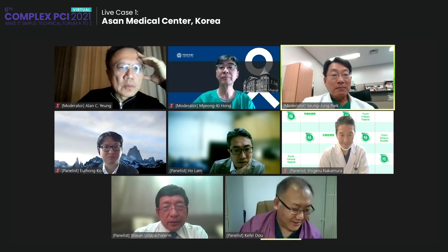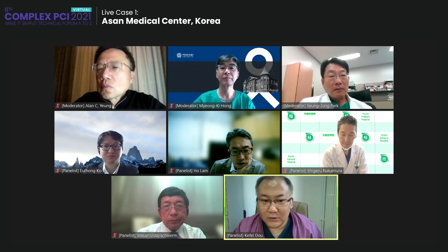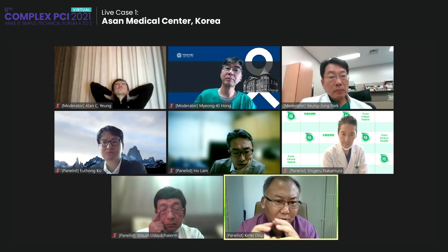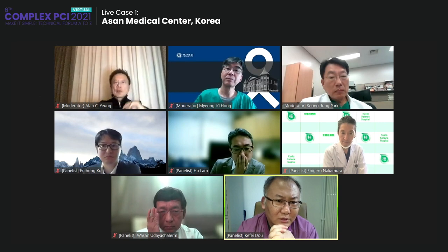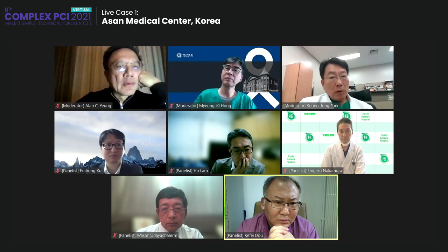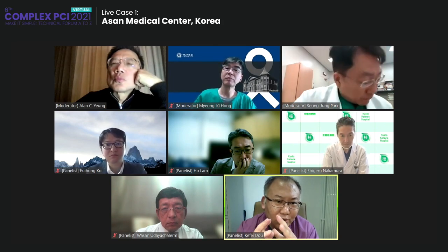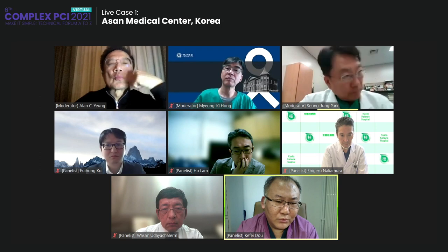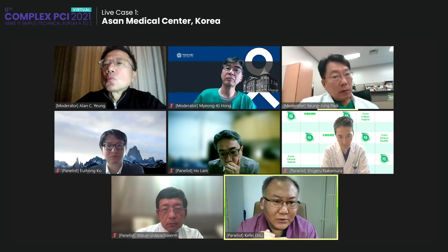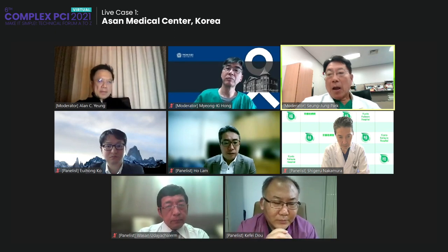All right, Dr. Du. Yeah, I have a question about the final kissing will increase the TLR rates, and the TLR is only at the ostial lesion there. Where is the revascularization rate? You mean? I mean, for some jailed circumflex, we usually do the kissing balloon. And in your paper, that will increase the revascularization rate. TLR or TVR or.